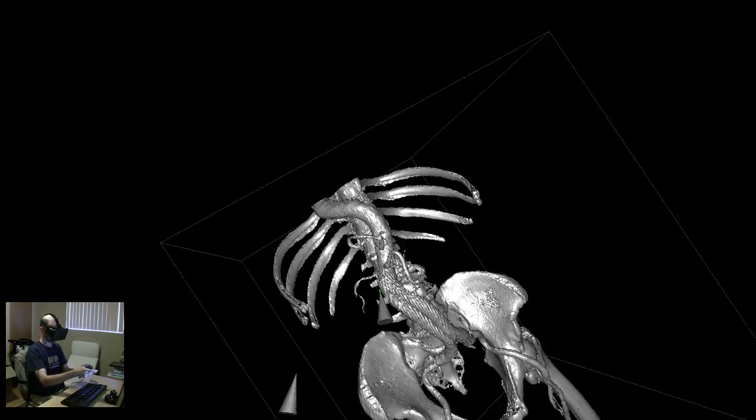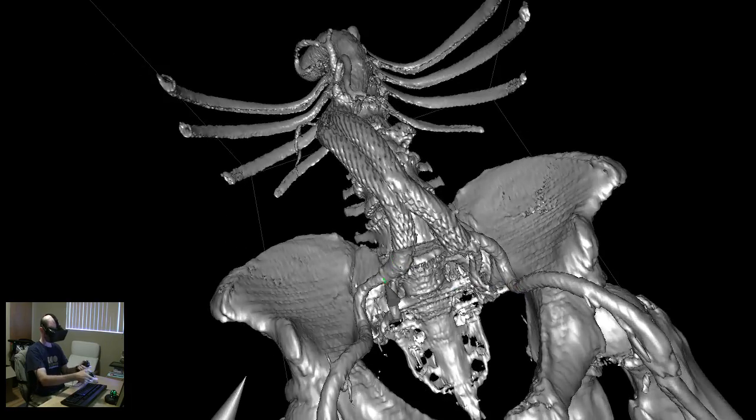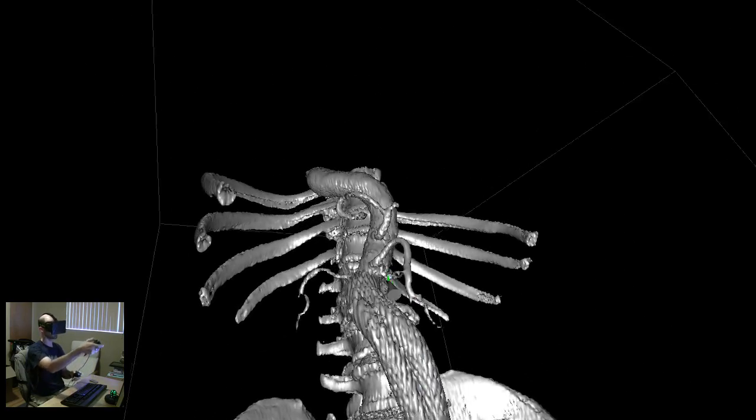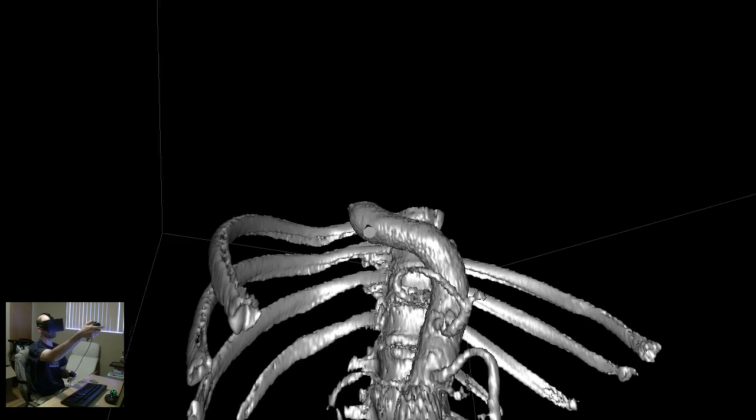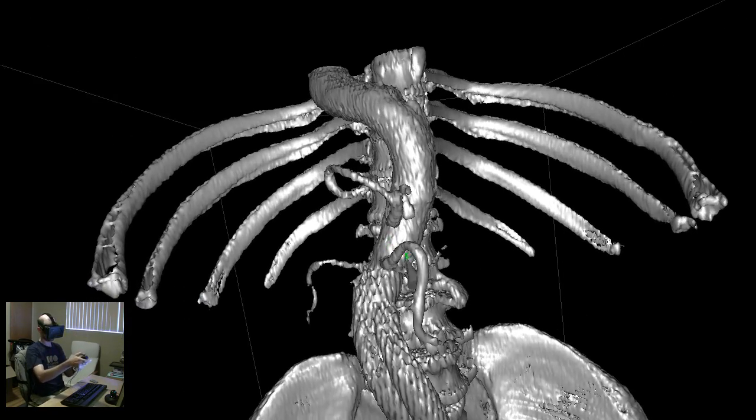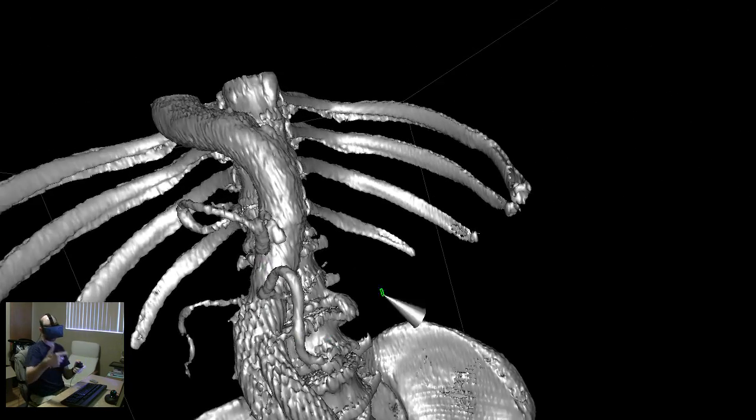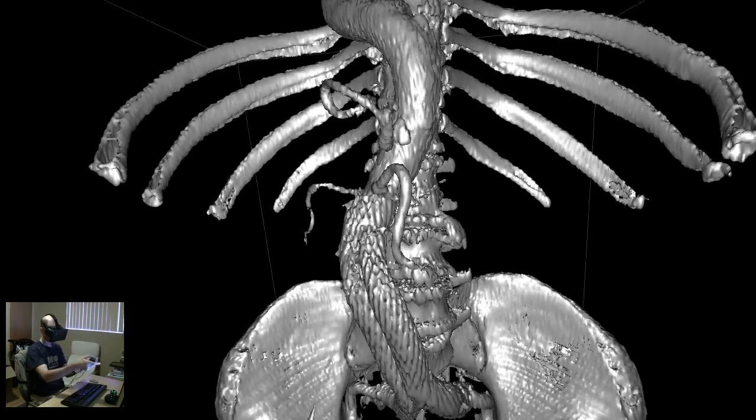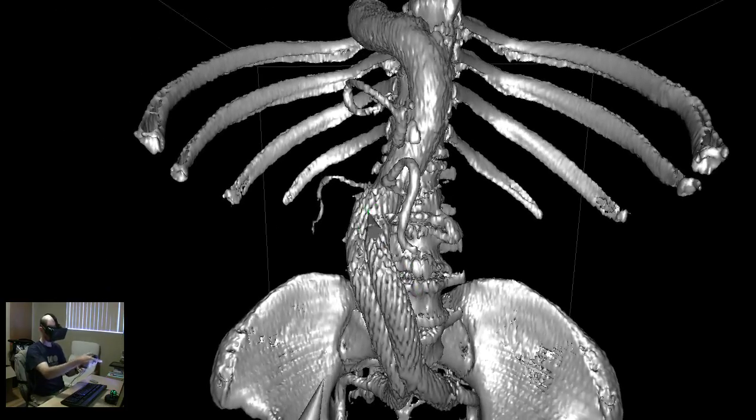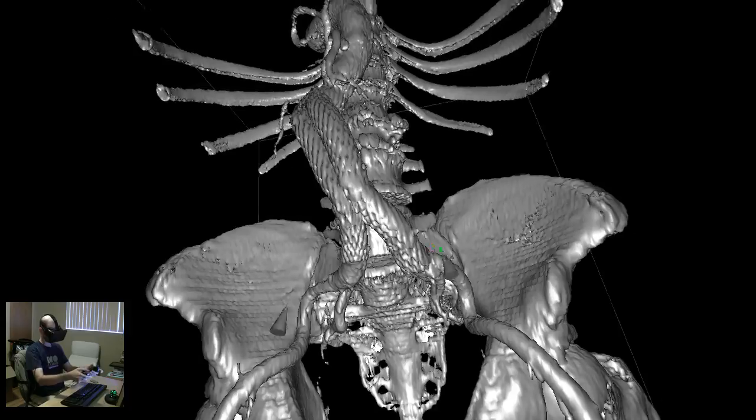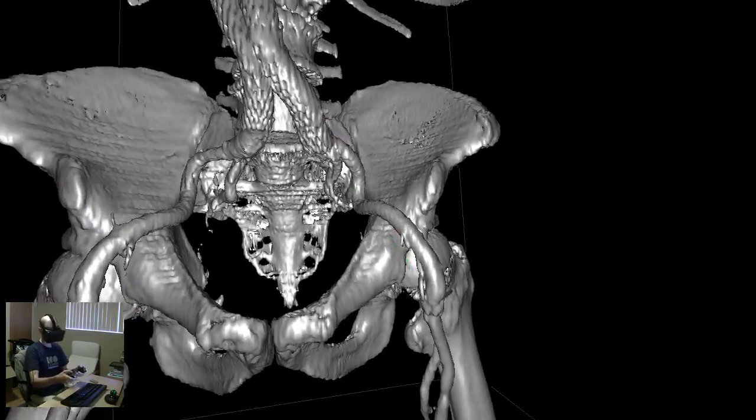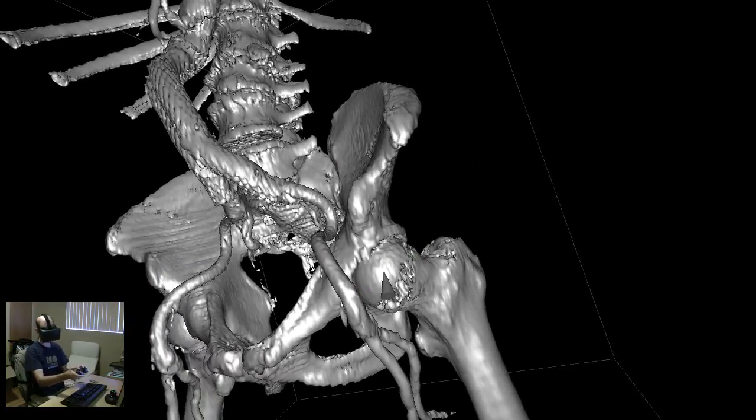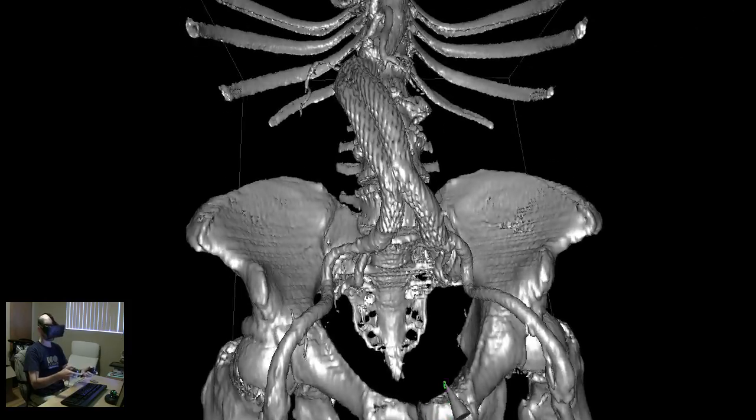So here we have now the aorta, which comes down here, which is tremendously big. At that point here, it's probably about the diameter of my thumb. And then it splits. And then down here, it turns into the femoral arteries that go down the legs. Here, of course, we have the hip joint on either side.